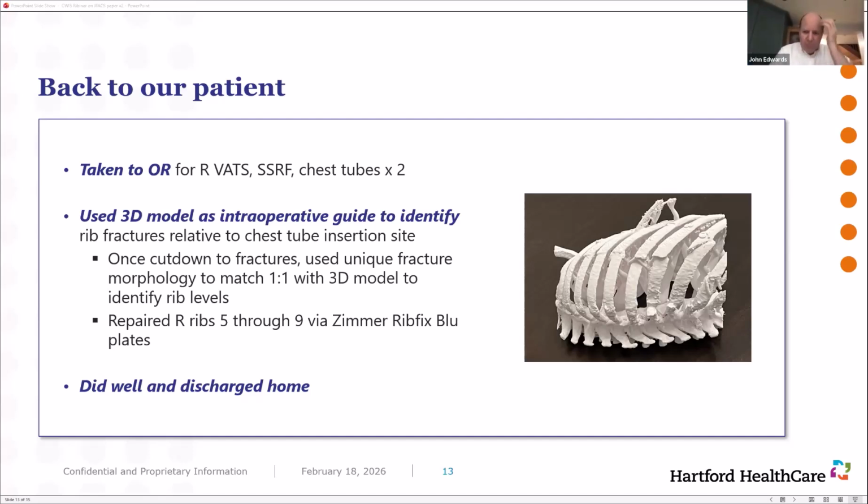Go ahead, Dr. Edwards. Sorry, yeah, I have an idea that is slightly left field for this, but for external thoracic plate formation, there's no reason that a clever industry partner couldn't take a CT scan. Say you want to fix the left sixth rib, you take an image of the right sixth rib, flip it, invert it, so you know the shape, and that means you can then create a plate.